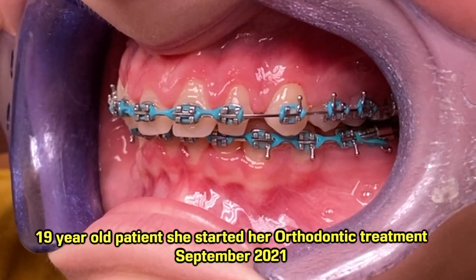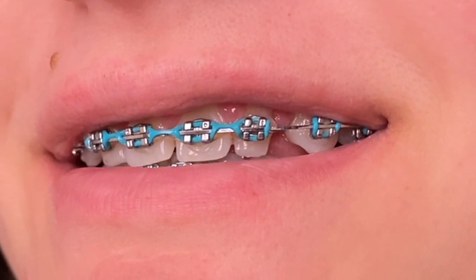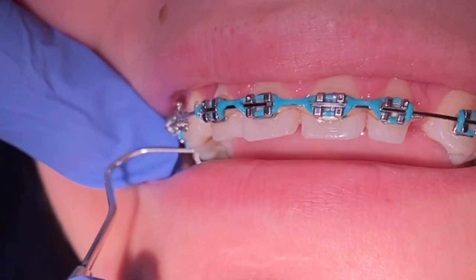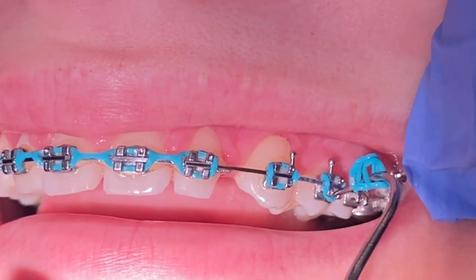This is the patient who started her treatment in September of 2021. We are currently in her 14th month of treatment, and in today's visit we're going to go ahead and change her wire. As you can see here, we're going to take off her colored o's — which are also her single colors — and then her lower 66 chain.